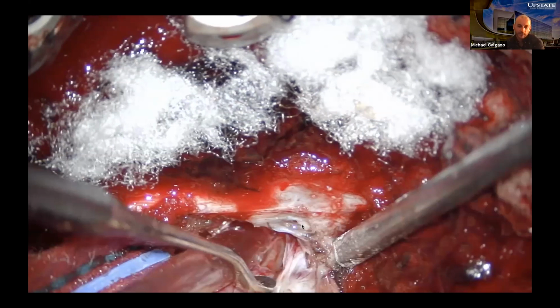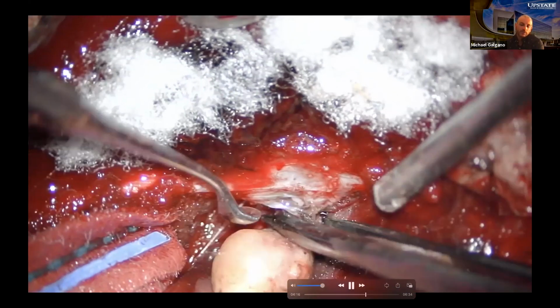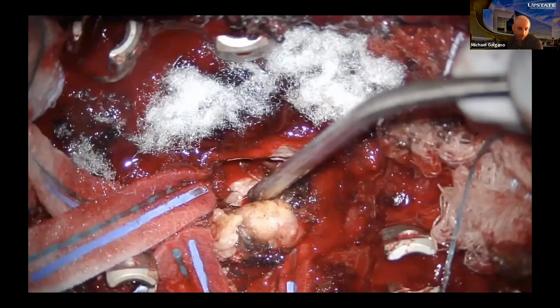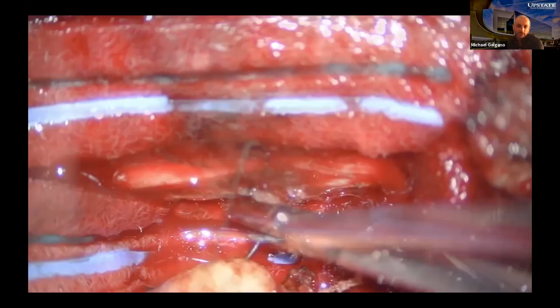As you can see, there's a lateral dural defect here, which we ended up sewing up as well afterwards. Once we get this part disconnected, then we really just need to disconnect the lateral part of the tumor off the runoff of the lateral component of the T10 nerve root. Once we repair this, then after that, it's all about retropleural dissection, staying out of the pleural space.